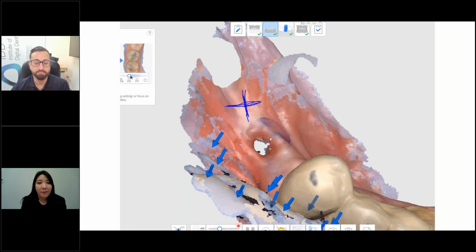And the default option is the second one. So do you switch it depending on the cases? I personally control most of the soft tissue clinically, so I don't like to play around with the software too much. I like to have one setting that I like and I just use it, and I don't spend time every case changing the software. Be aware, guys, that this software is there to help you.